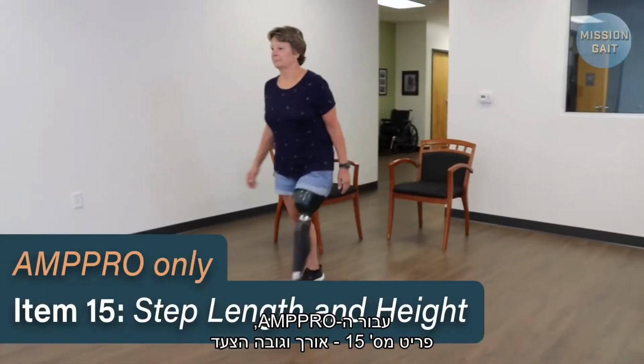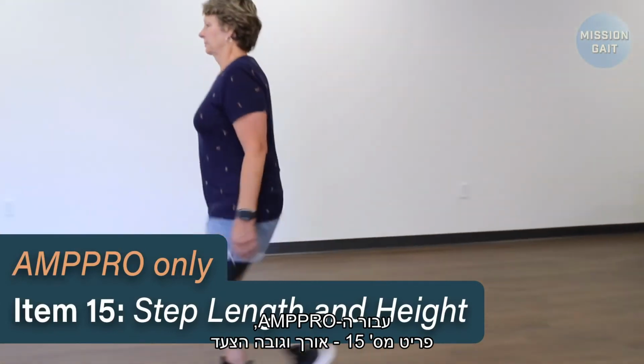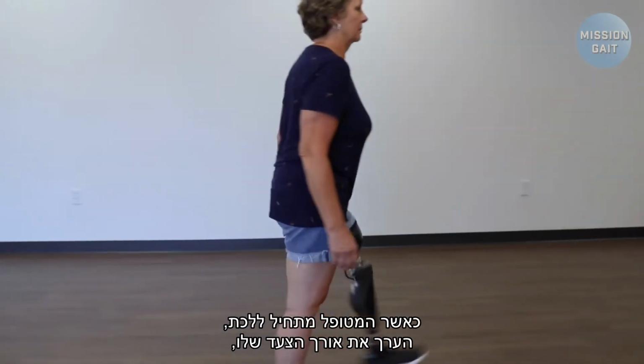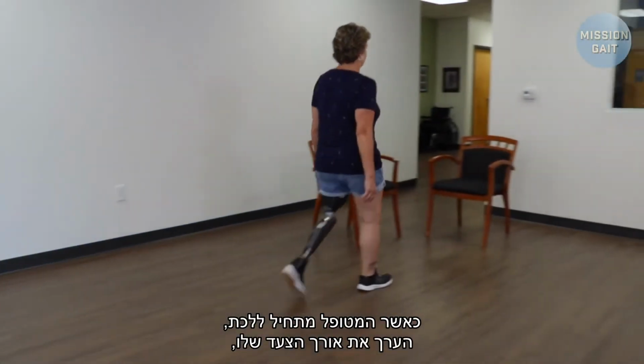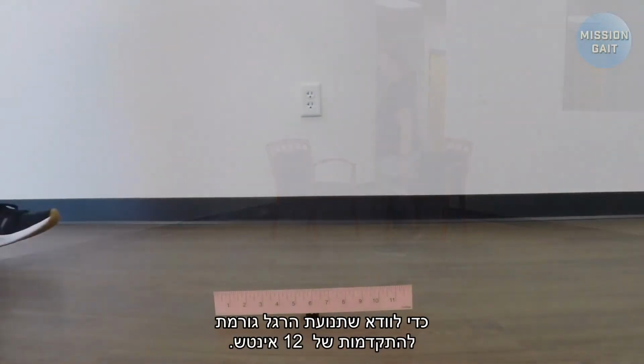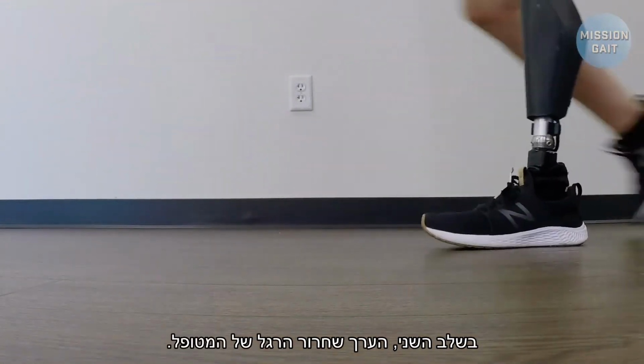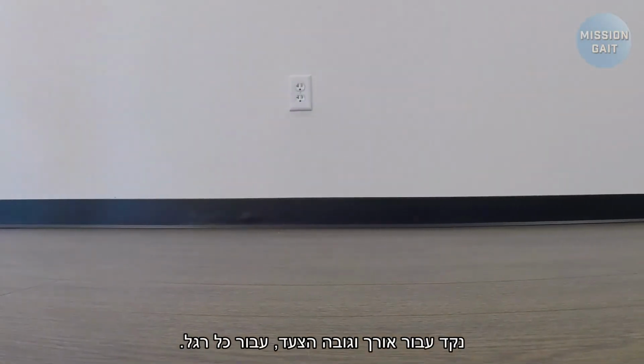For the Amp Pro, item 15, step length and height. As the patient begins walking, assess the patient's step length, looking for the swing limb to advance 12 inches. Secondly, assess the patient for clearing of the foot. Score for both step length and height for each limb.